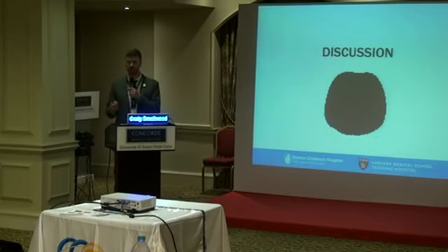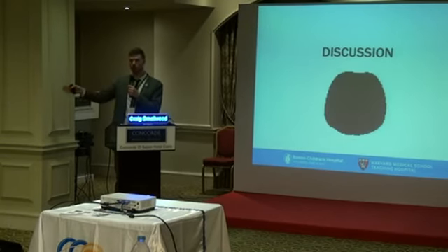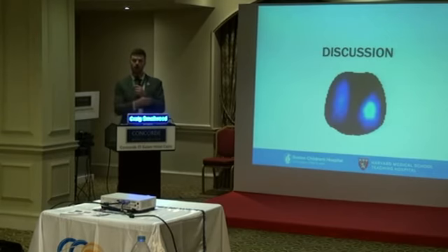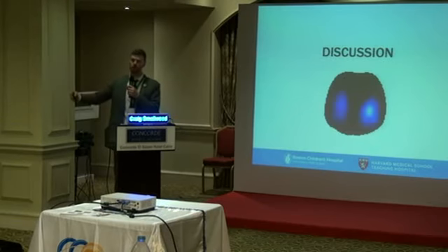So what we have done serially, we're doing an observational protocol right now whereby before a patient is intubated, we get an EIT image, they get intubated, and every single day we'll get an image through to 24 hours after they've been extubated. And what we are going to do is look at the changes in electrical impedance, distribution of ventilation, inhomogeneity in terms of compliance of the lung, and show that on day 4 there was a marked change in the distribution from baseline, and that perhaps is reflective of or associated with some clinical outcome that was yet to manifest itself.